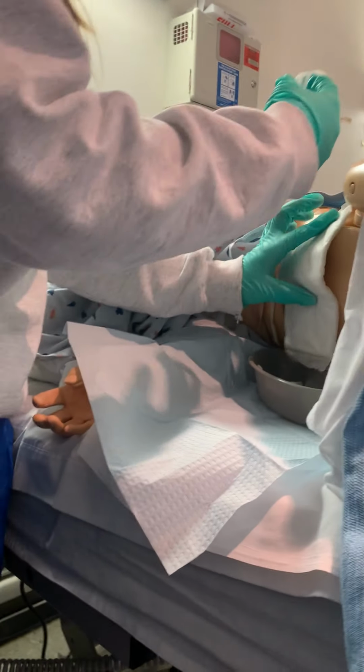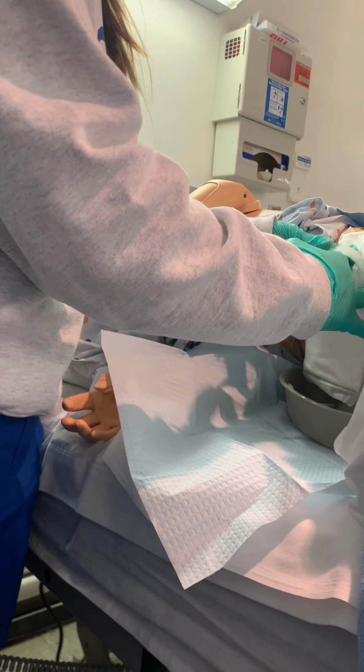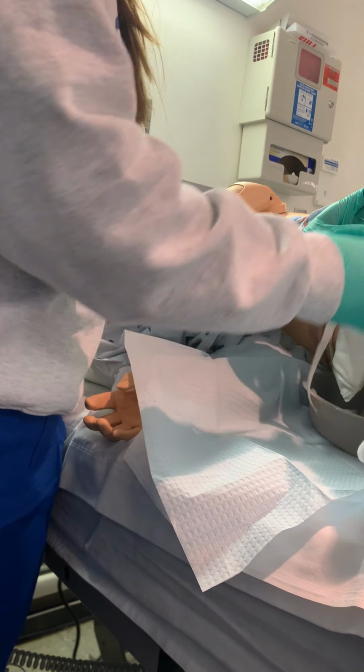And now I'm not going to press too hard on her skin. I'm just going to kind of let the tape fall.